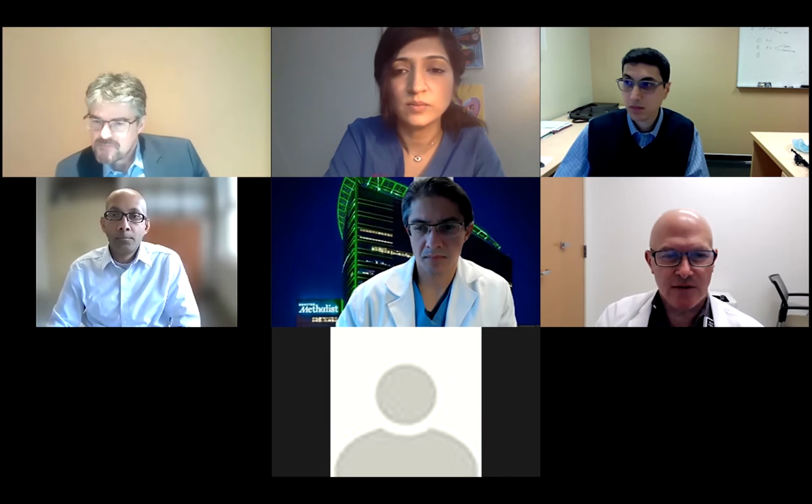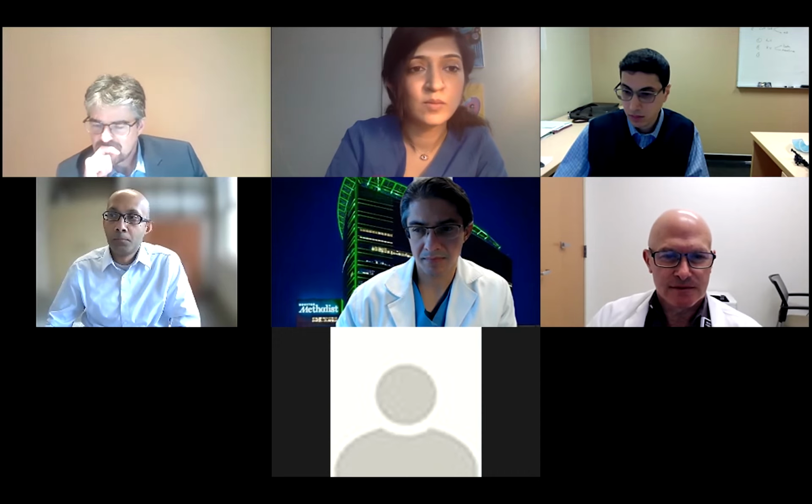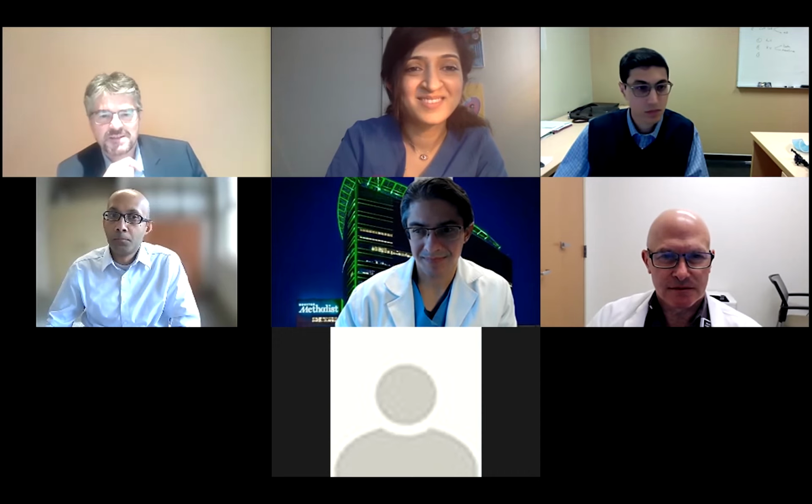There's a question that just came through, which maybe you might want to answer: which patients are not good candidates for stress perfusion CMR? You see, I don't have an immediate fast answer to that.